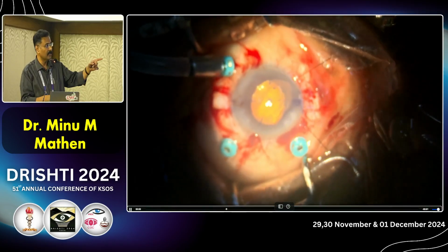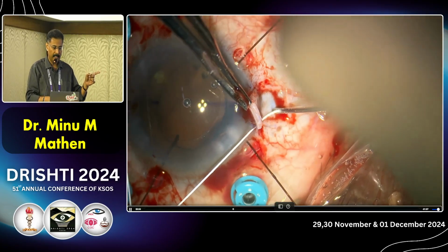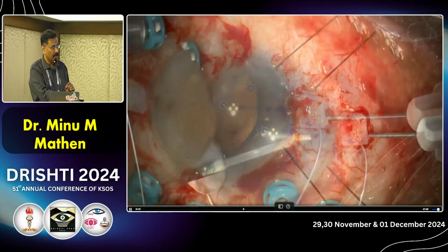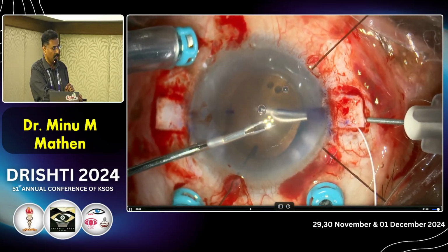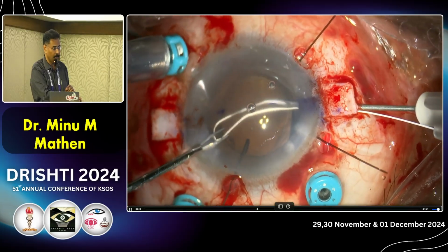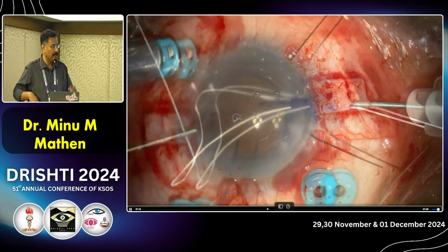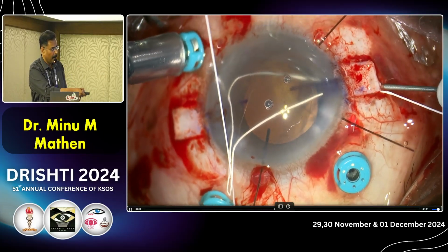And so this is the snare which is going to go inside. So your regular 2 millimeter behind anterior limbus, it goes inside, and the haptic optic junction. Look for the haptic optic junction and penetrate. This goes behind the lens complex, and it penetrates the bag and comes out. So this thread you can pull out because this is loose here. It can be pulled out through a paracentesis. Now you have to have a Gore-Tex thread which is cut, loose Gore-Tex thread. And that can be cut. Loose Gore-Tex, one end of it is put into this snare, and you pull it out.